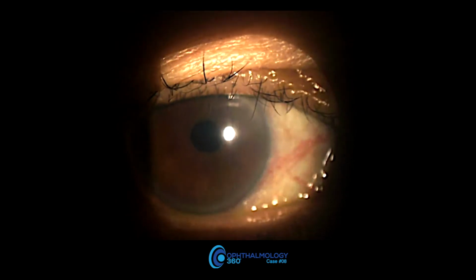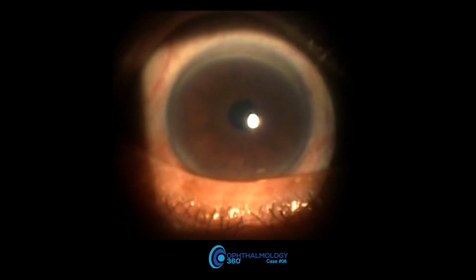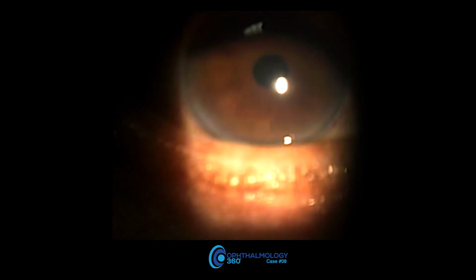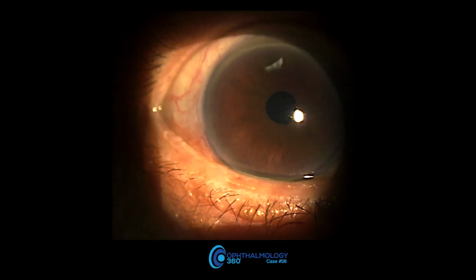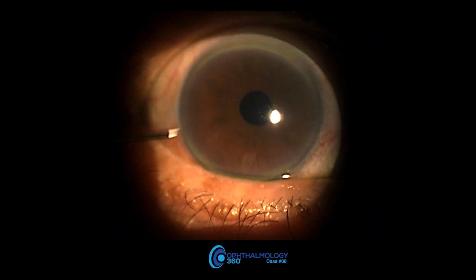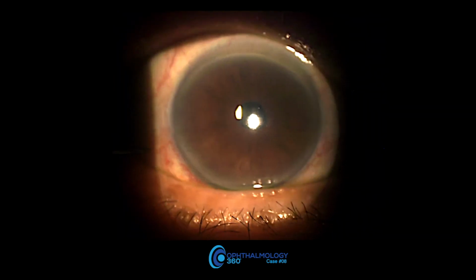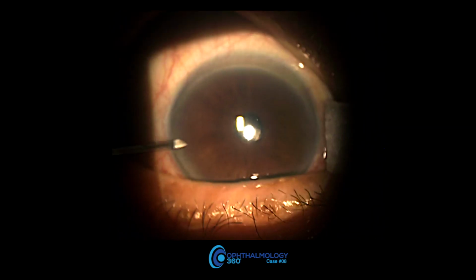So this was, I think, the second patient I ever did. At this point, I thought it was a great idea to use a staff member to hold the lid, and at that point I was trying to use Weck-Cels soaked in proparacaine. I didn't realize that you would have no counter pressure with them. So this is essentially non-counter pressure, and you're going to have a little trouble initially figuring out where your hands are and how you want to approach the eye. So you can see I'm trying to figure out, okay, how do I want to get in here? What angle do I want to go?